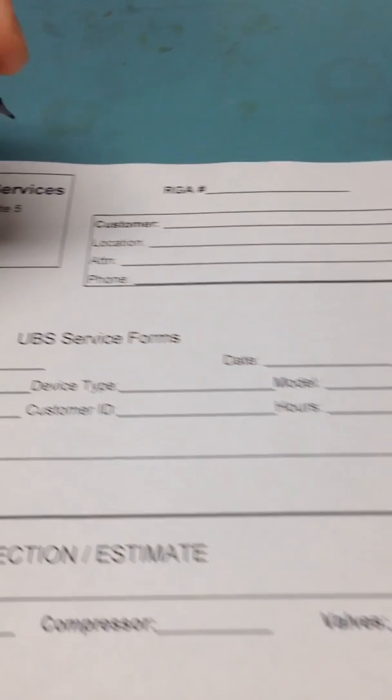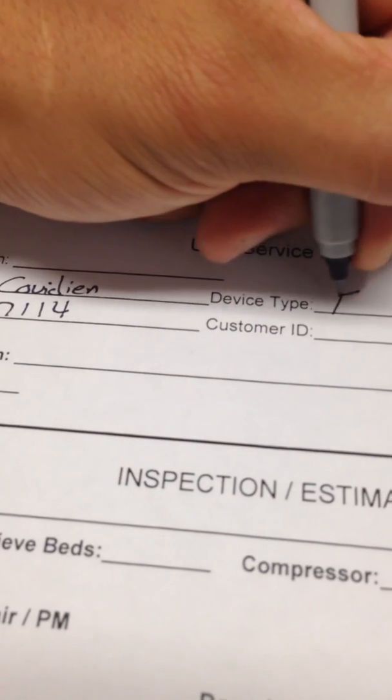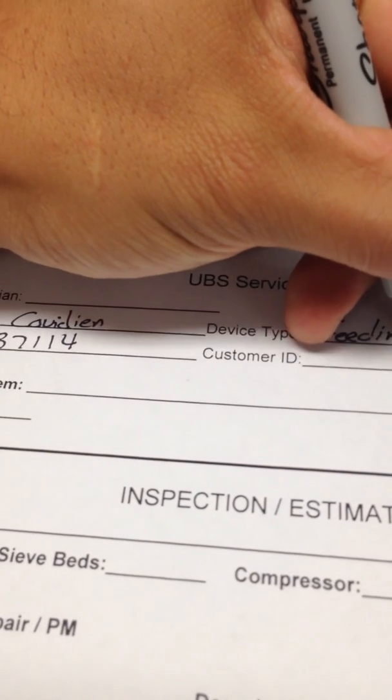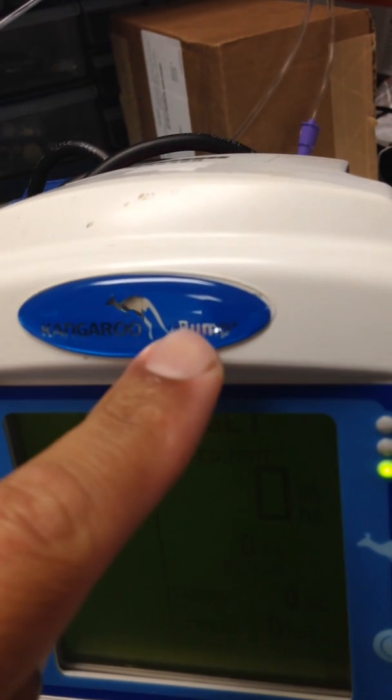The device type is going to be feeding pump. The model is right here — it's a Kangaroo ePump, so the model is going to be ePump.